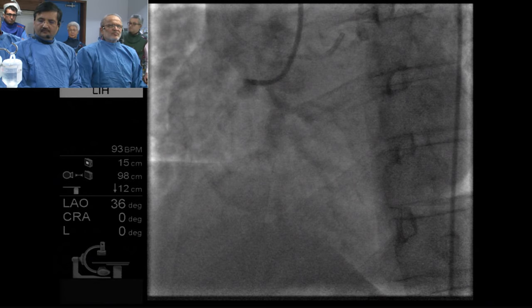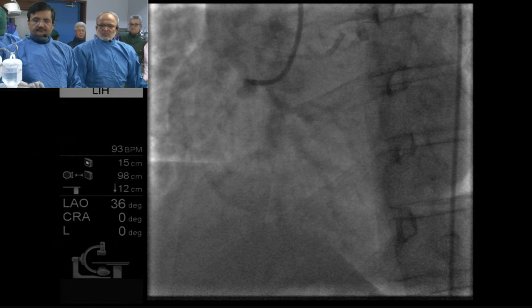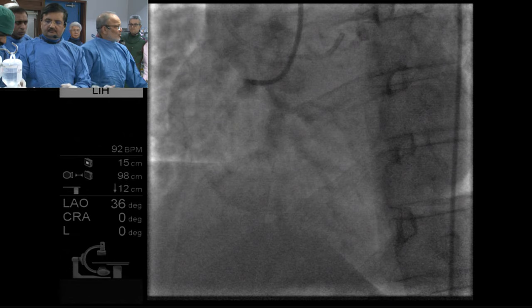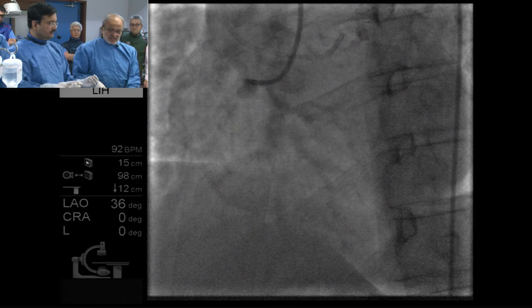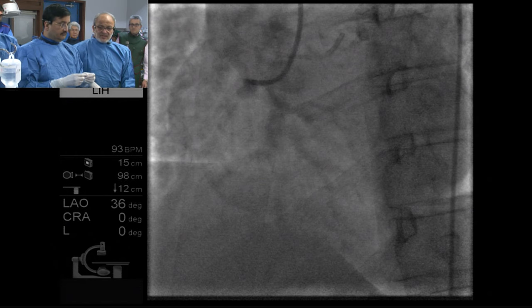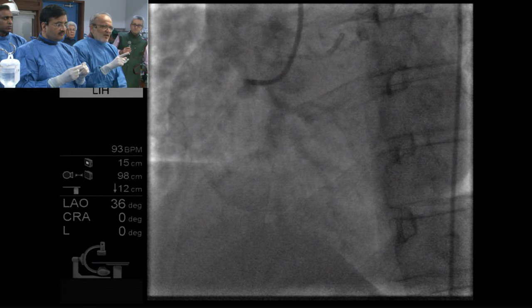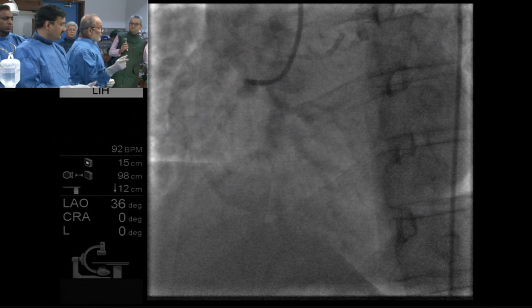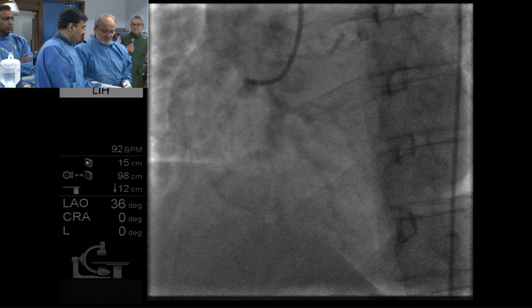How crucial is the support of the guiding in this case? It is a lot more important. And I tell you, the guide catheter support is also not all that bad in this case. But the lesion is very tough. With this tough lesion, even if you have left Amplatz, it will have a tendency to flip back, and that will be very dangerous. I agree with you.